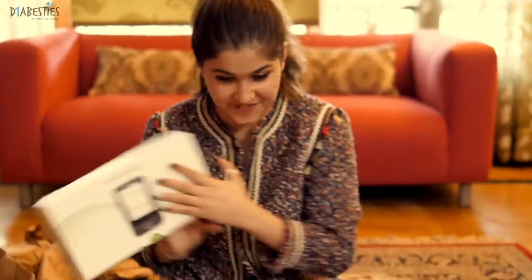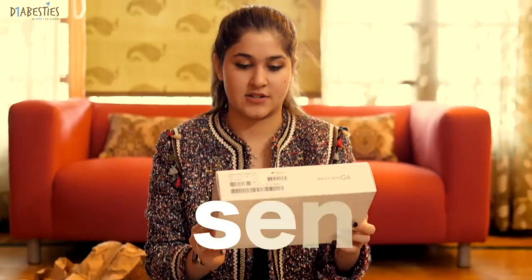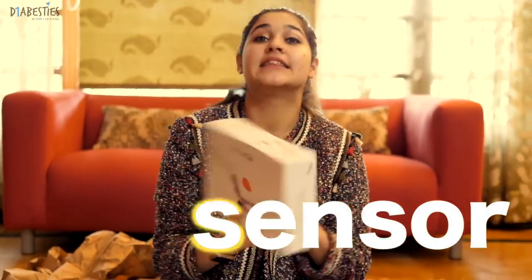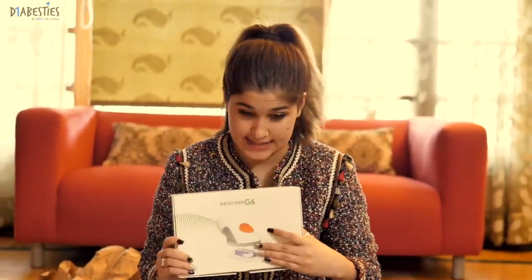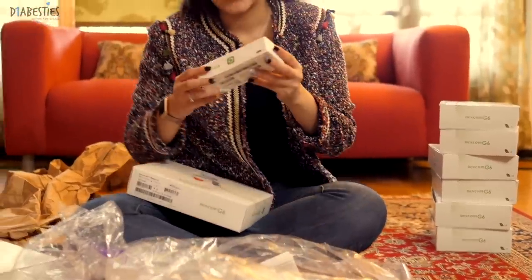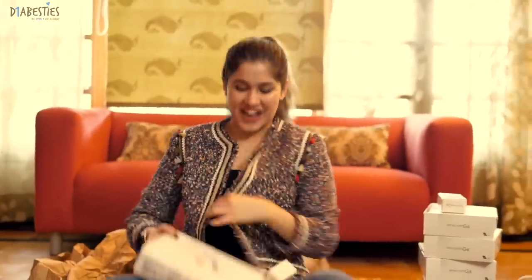So this is the receiver, this is the sensor — yes, this is the sensor, and it has to be changed every 10 days. And then this is the transmitter, which changes once in three months. And we have the sensor which changes once in 10 days, and then we have the receiver which changes never. Oh my goodness!